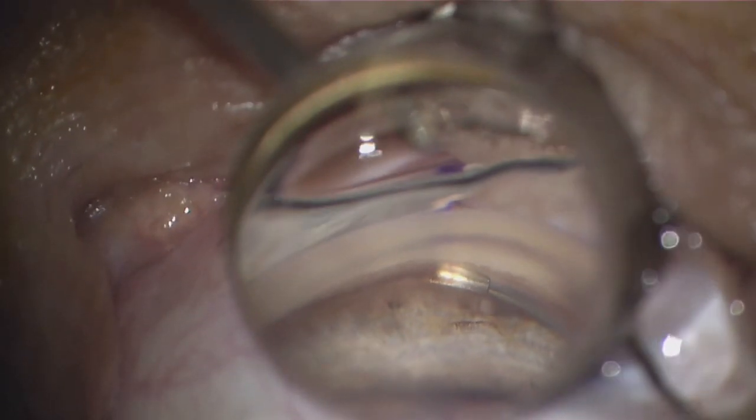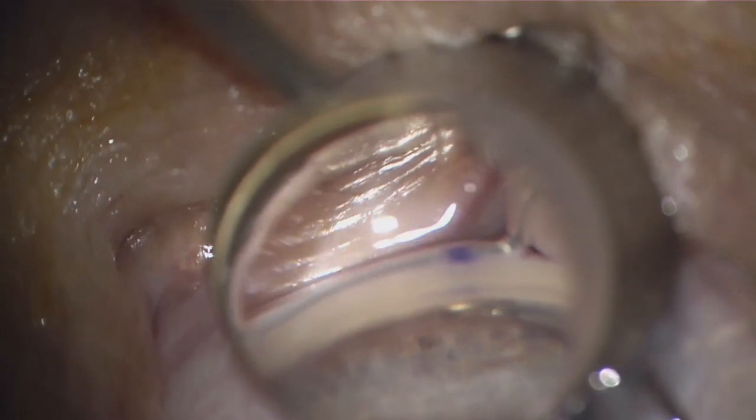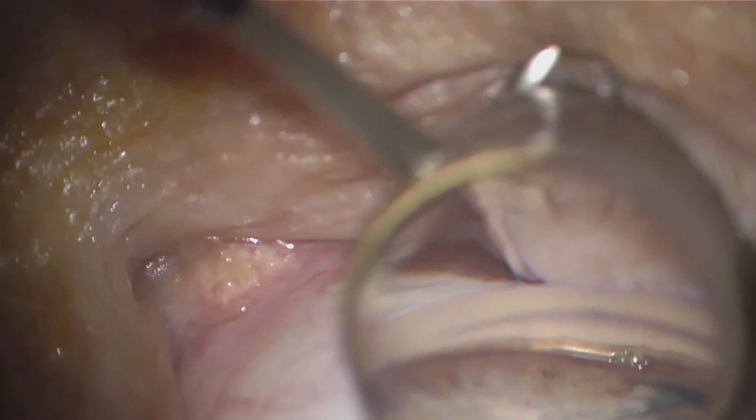One last point is to hold the cannula steady, keeping the tip engaged in Schlemm's canal. By docking the cannula tip, you have a higher probability of delivering the stent with 50% of the transition zone covered, minimizing the need to adjust the stent after deploying it.